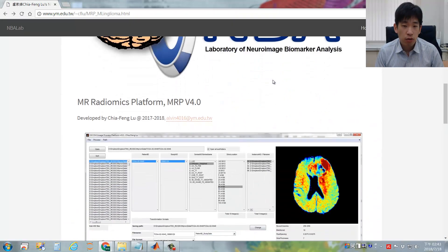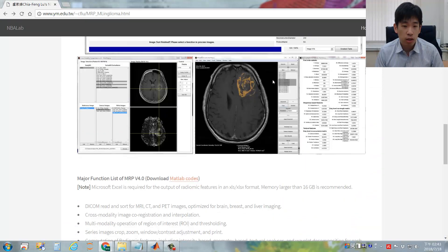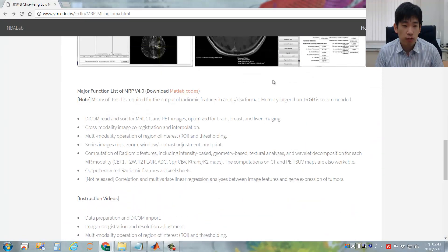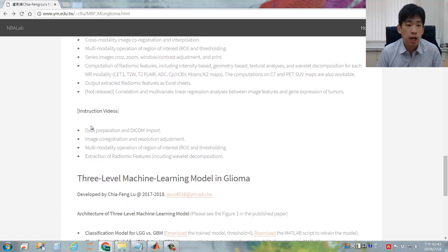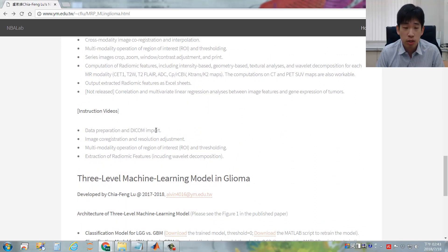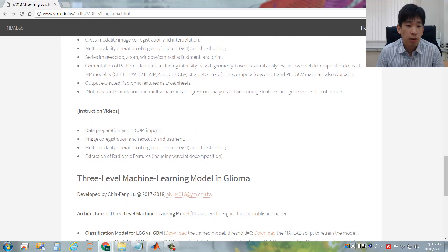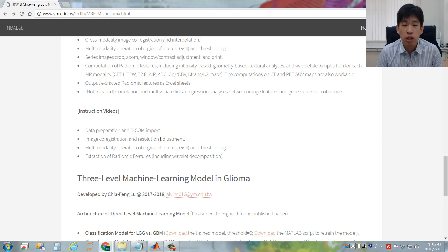The following demonstrative videos will include four different parts. First, the data preparation and DICOM import. Second, image co-registration and resolution adjustment.